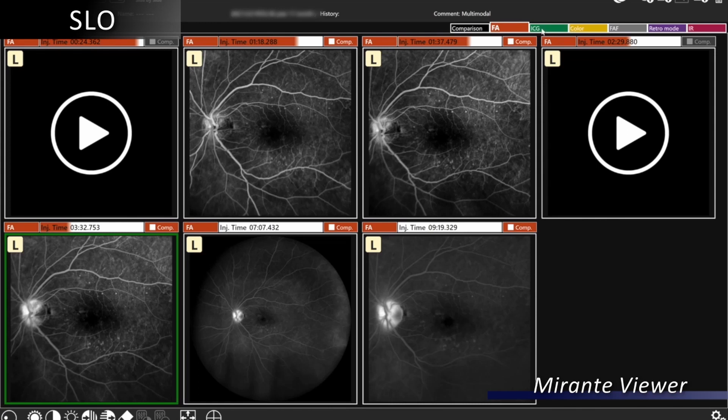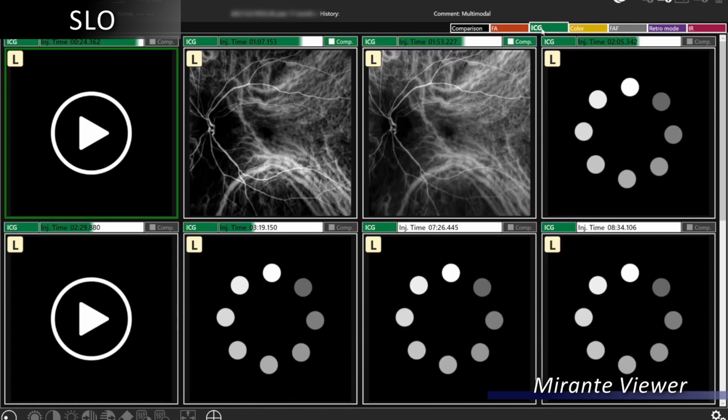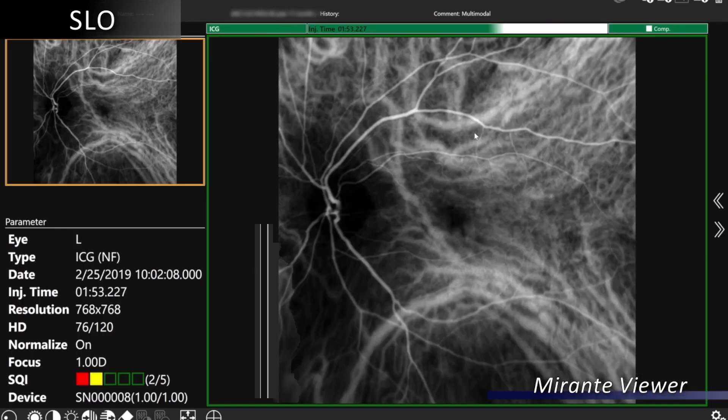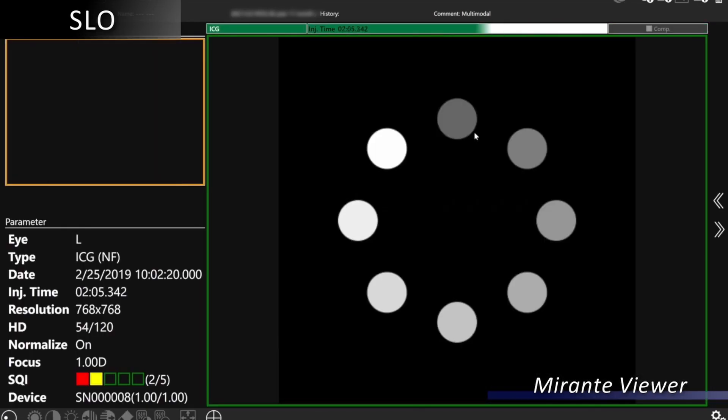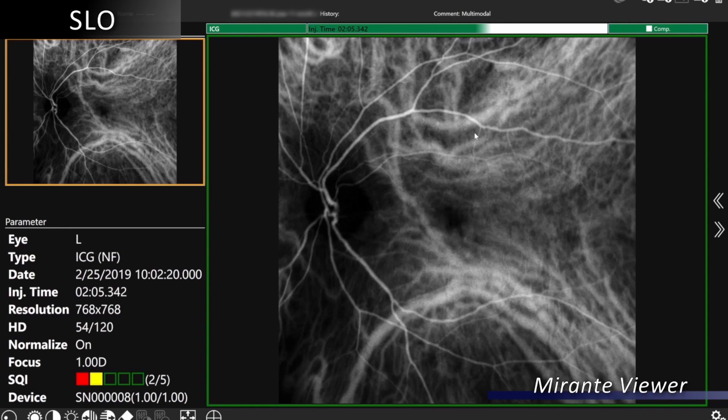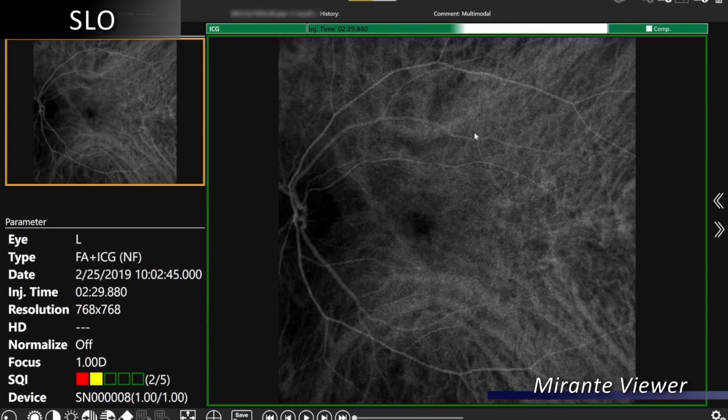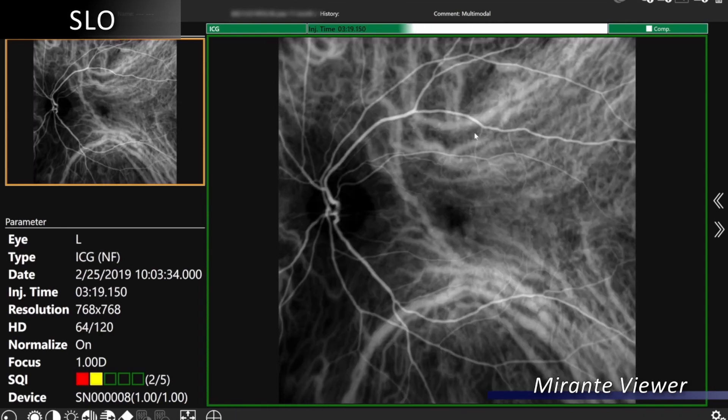On ICG, we can also do the same with static imaging and look at early phases, mid phases, and late phases.